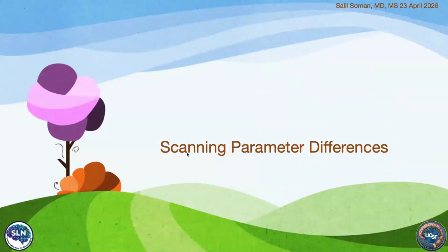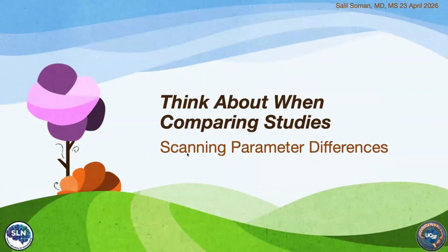So here I'm just going to touch on the fact that just because you order an SWI or a QSM, depending on where it comes from, you could get very different images. That's what I wanted to show here: things to think about when you're comparing studies. I've encountered clinicians who have said, oh, the GRE or SWI signal looks much bigger. And it's like, well, one was at a different field strength or different scan parameters. Again, that's just what I want to touch on here.